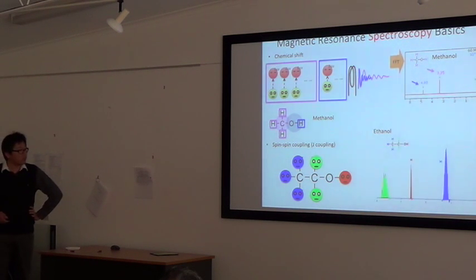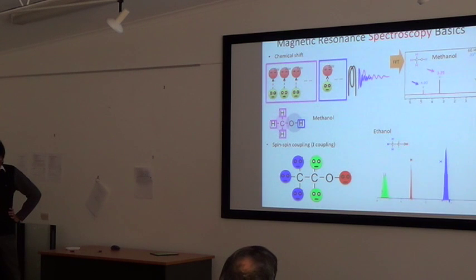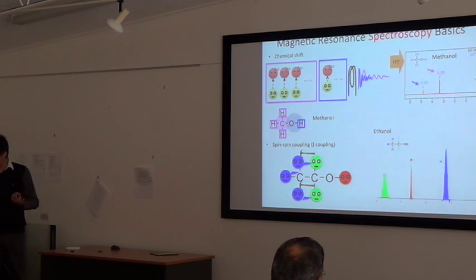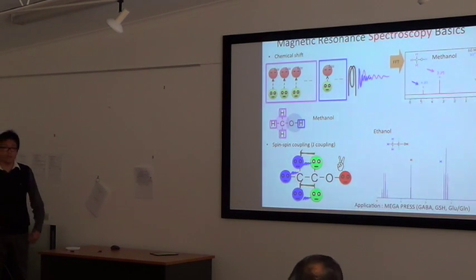So if I do the same thing, we find three peaks on the frequency domain. Okay, the green one and the blue one are so close to each other that they start to interact with each other. And on the frequency domain, what you actually observe is small splittings of the peaks. Instead of one main peak, you have several peaks. And the red one is so far away from the other neighbors that you don't get any interactions. So it's only one peak for the red.